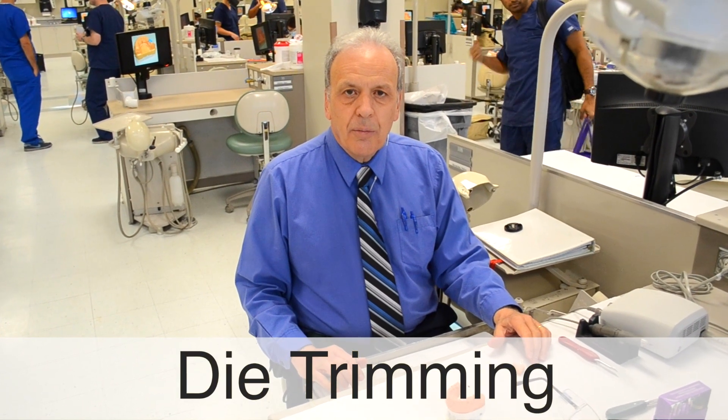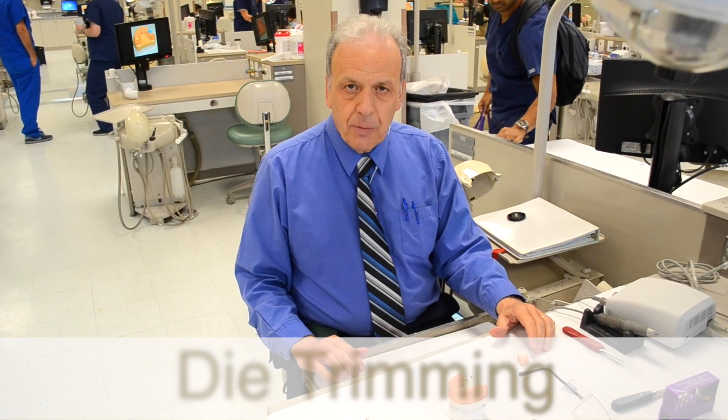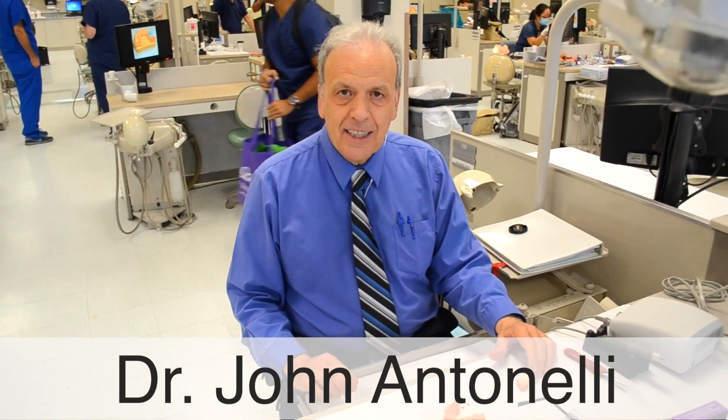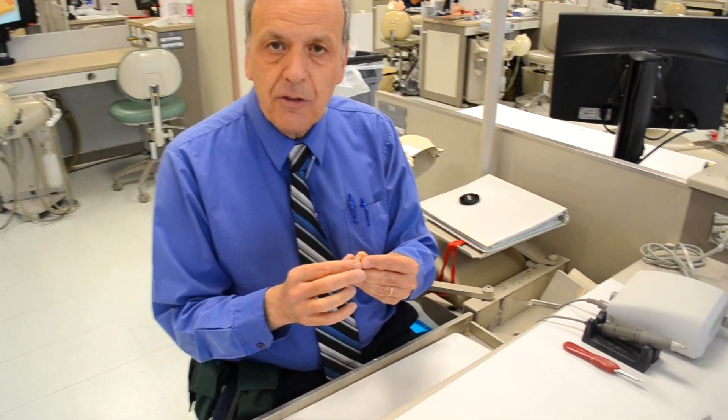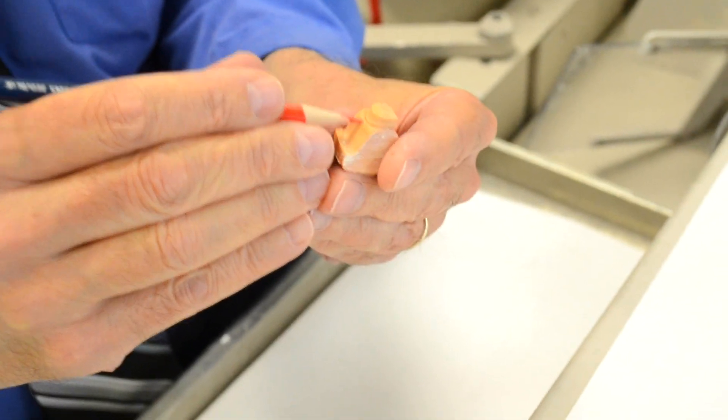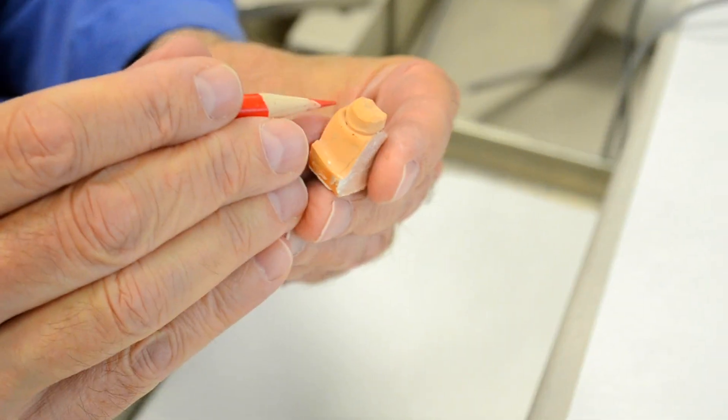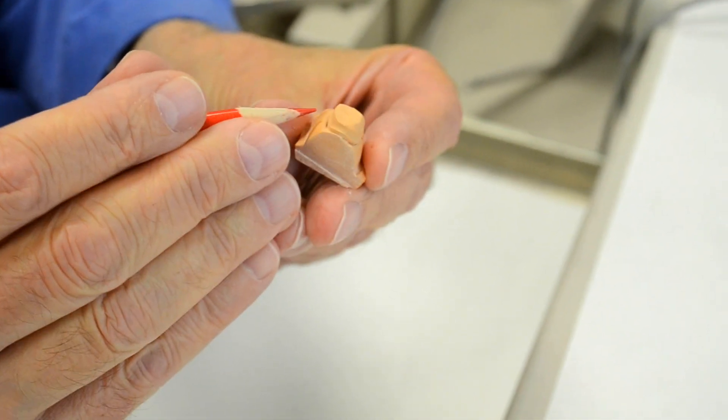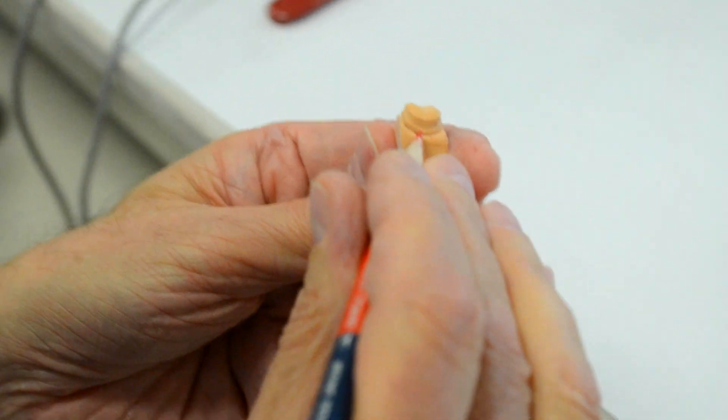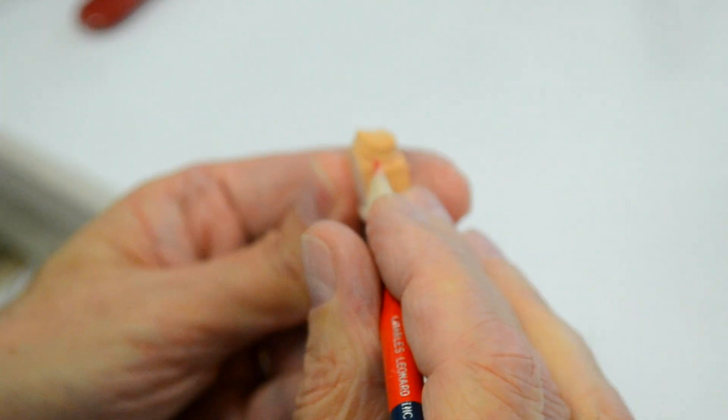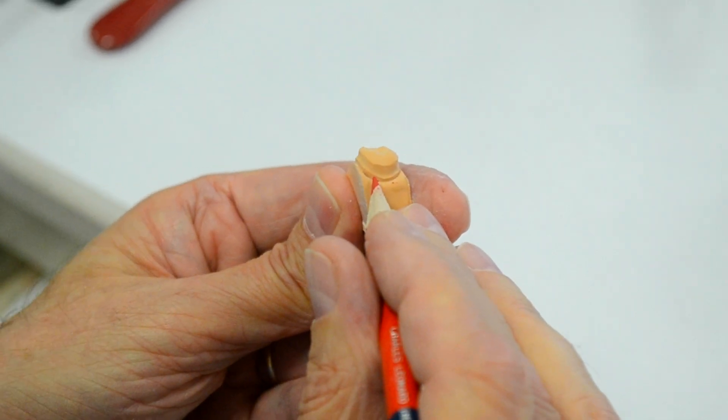Today we're going to perform a procedure known as die trimming. By the way, my name is Dr. John Antonelli, and we are going to perform a procedure entitled die trimming, which is performed on removable dies of master casts for the purpose of removing all of the free gingival margin on the die 360 degrees around the die. By doing so, we uncover the finish line and make the finish line a lot more accessible for waxing perfect margins.